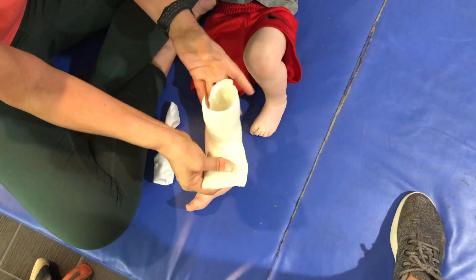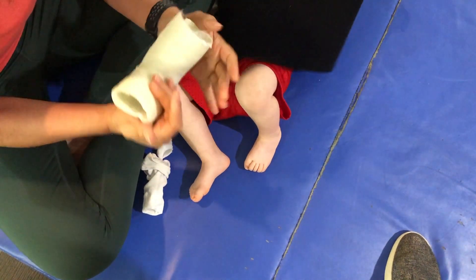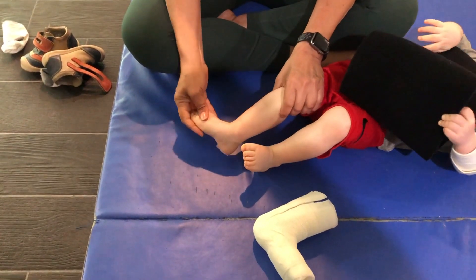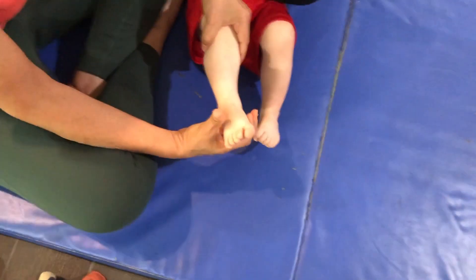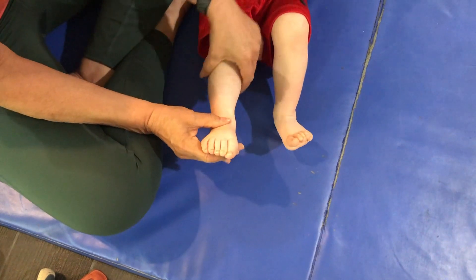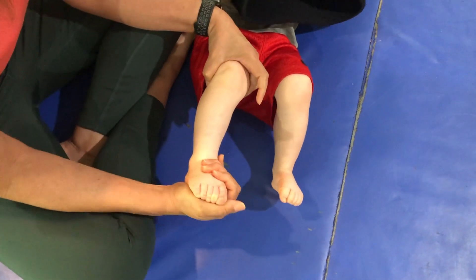This is not serial casting. This is dynamic flex cast that lets the kid move his foot in the direction that we need. His foot was pointing down and out. This was to position his foot in the direction that he can actually glide and move his foot up and down and be able to walk.